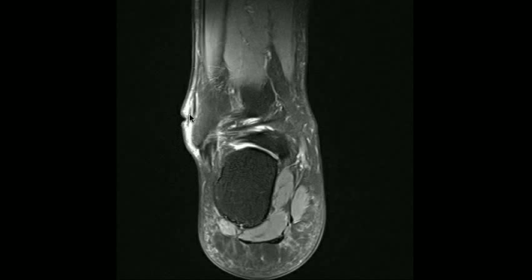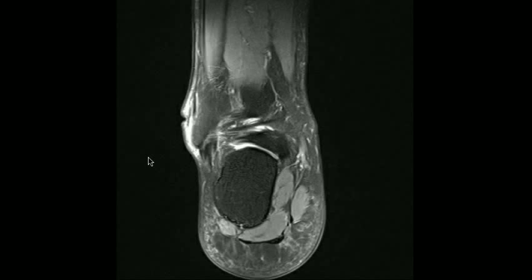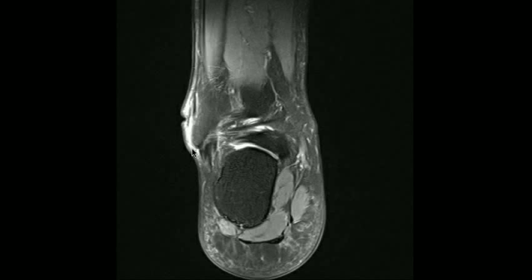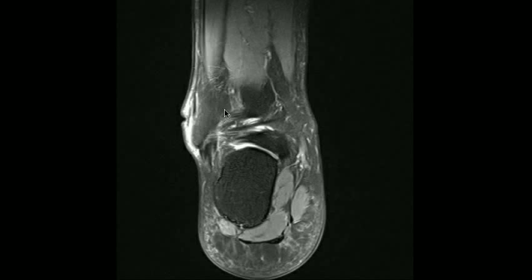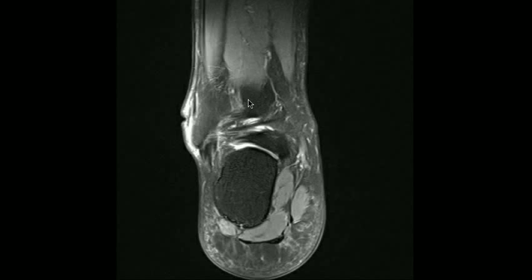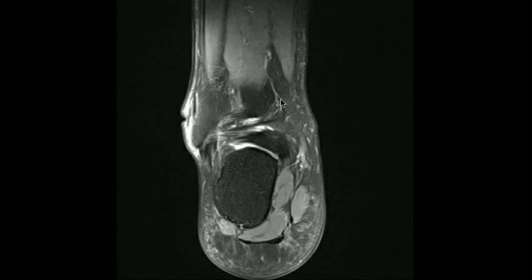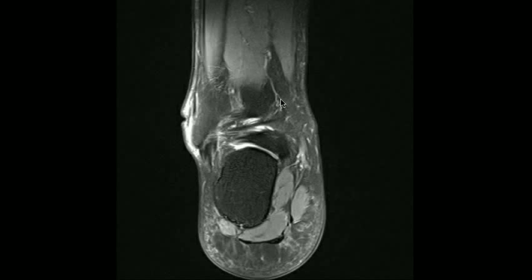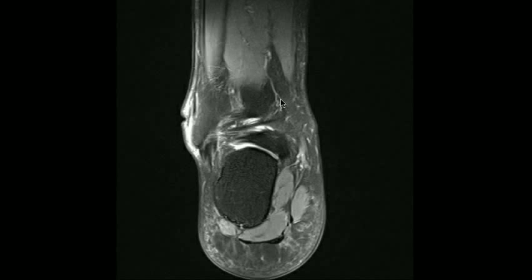Just to note the skin laceration with associated soft tissue edema present in this patient — the ligaments in this patient are intact. As we go from the lateral aspect, we see several ligaments. The most proximal, along the posterior aspect, extends between the lateral aspect of the distal fibula and the lateral aspect of the distal tibia. This is the posterior tibiofibular ligament, identified on the axial acquisitions at the level where the tibiofibular articulation is flat.